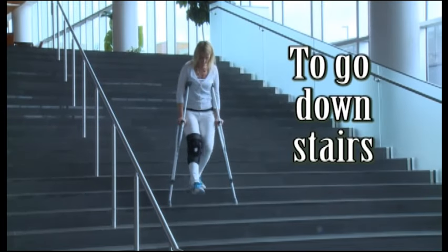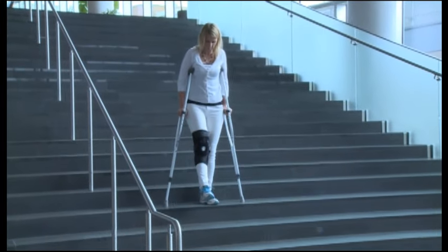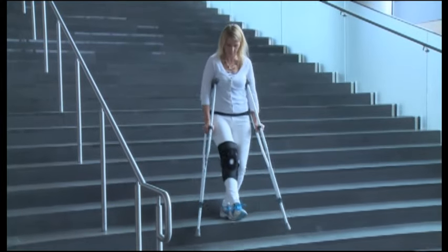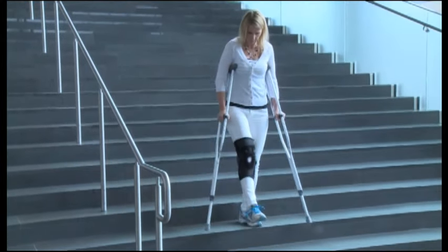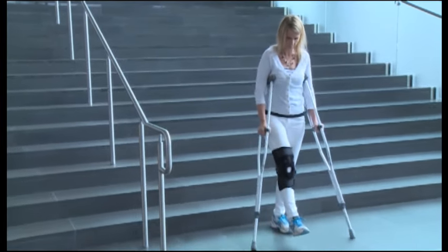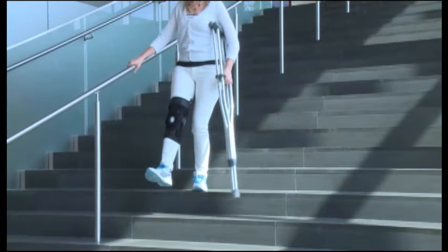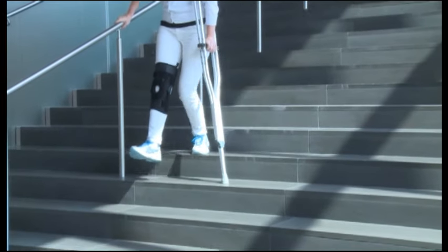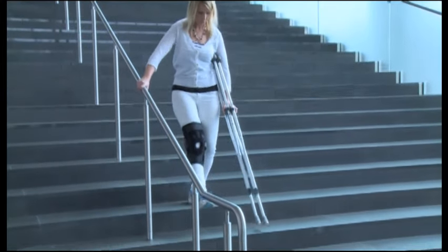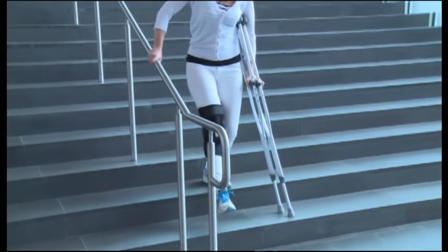To go downstairs non-weight bearing with crutches, start at the edge of the step keeping your hips beneath you. Place crutches on the lower step holding the injured leg out in front of you, then slowly lower yourself down to the next step. Check your balance before you continue. Make sure you bend at your hip and knee to prevent leaning forward, which could cause you to fall. If there is a sturdy handrail available, hold both crutches under one arm and use the handrail with the other arm. Hold your injured leg out in front of you, then place the crutches down on the lower step as you carefully lower yourself down.